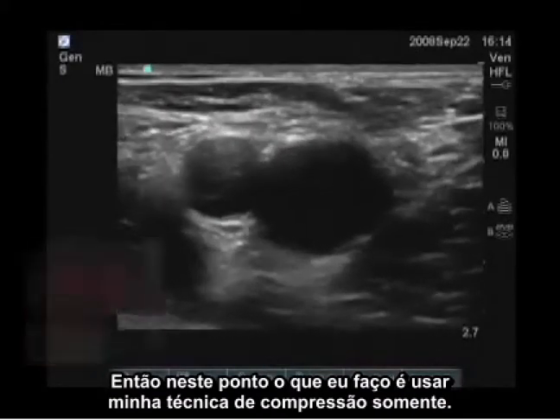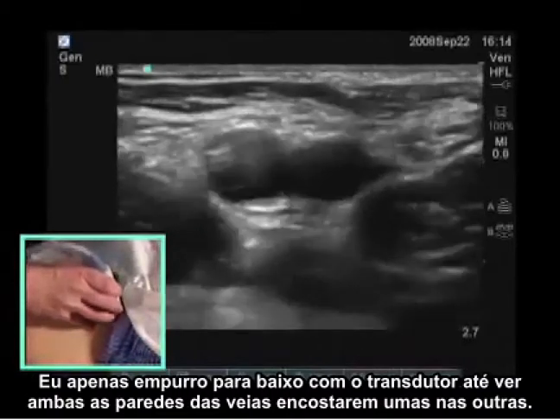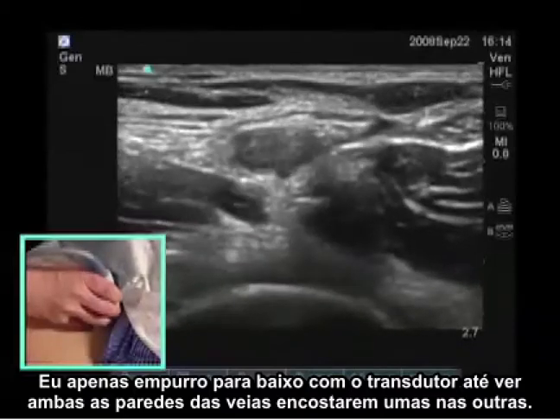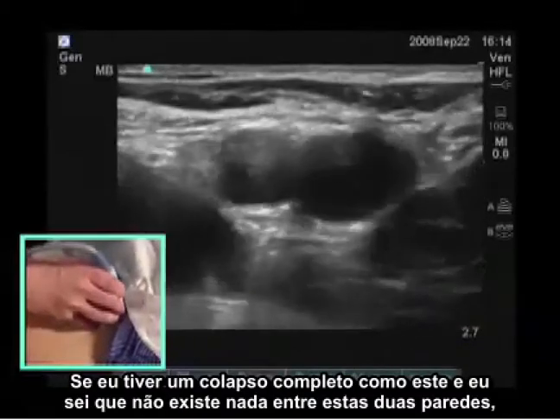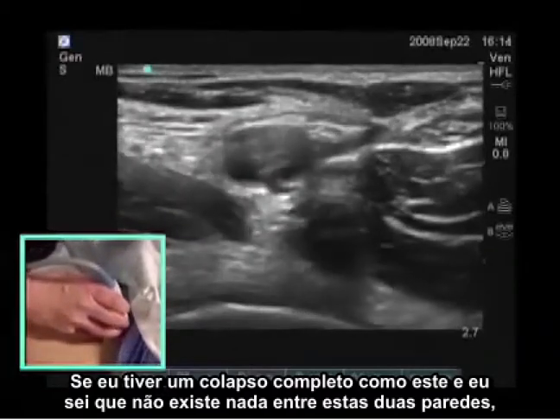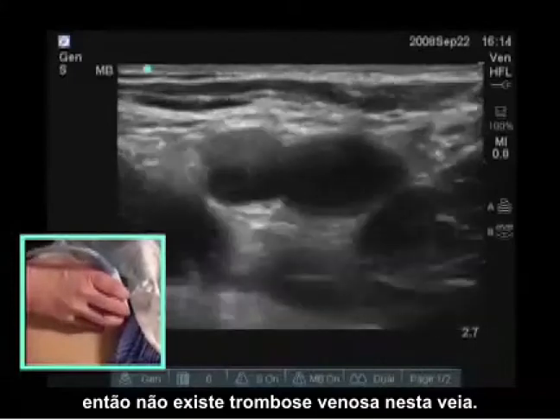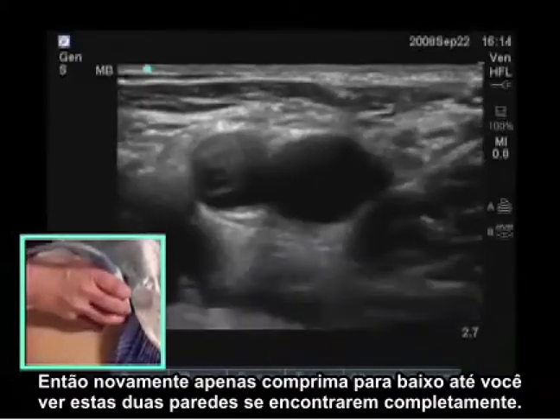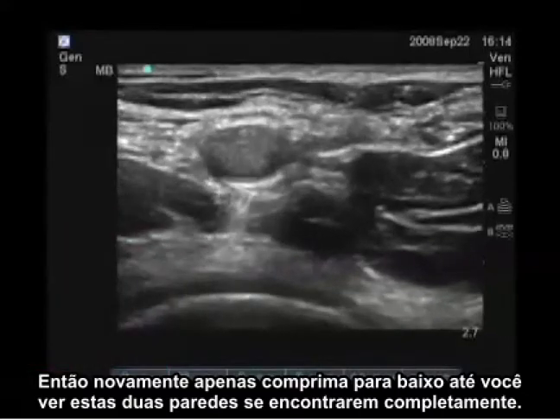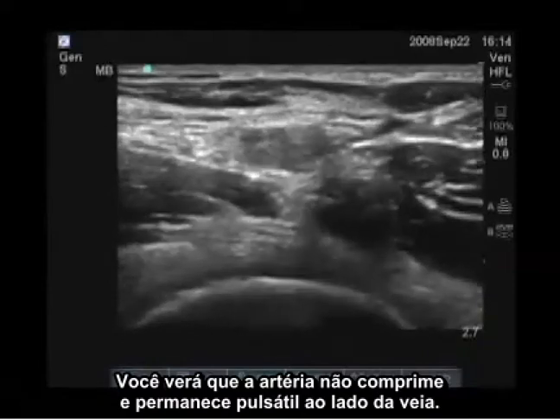At this point, I use the compression technique — I just push with the transducer down until I see both walls of the vein co-opt, or touch and meet each other. If I get a complete co-opt like this, I know there's nothing between those two walls, so there's no venous thrombosis in the vein. Just compress down until you see those two walls meet completely. You'll see that the artery does not compress and is pulsatile beside the vein.